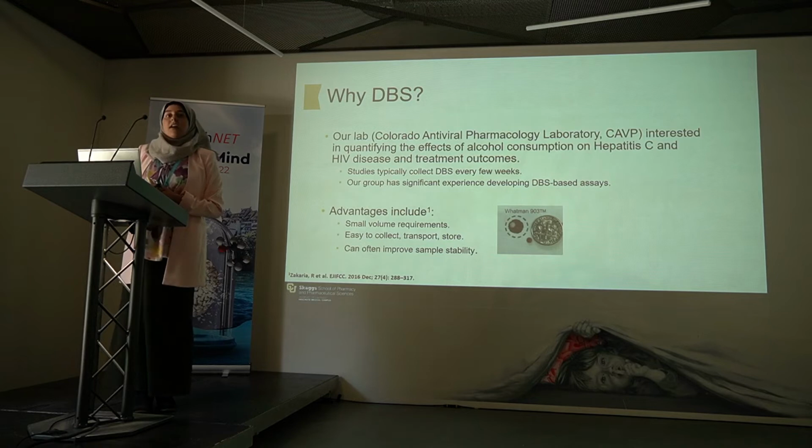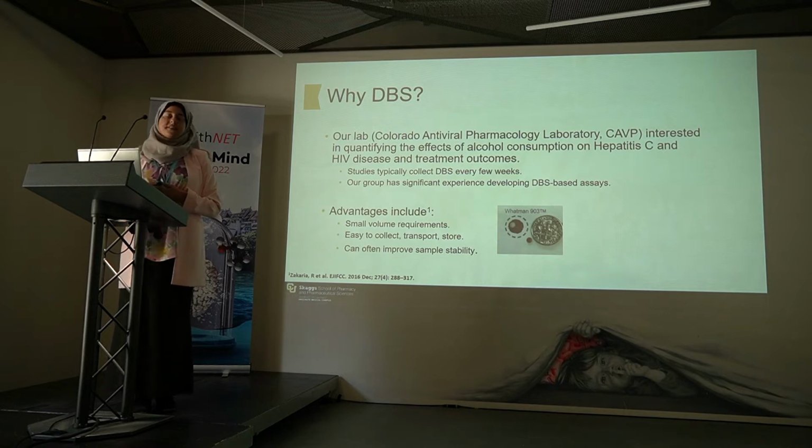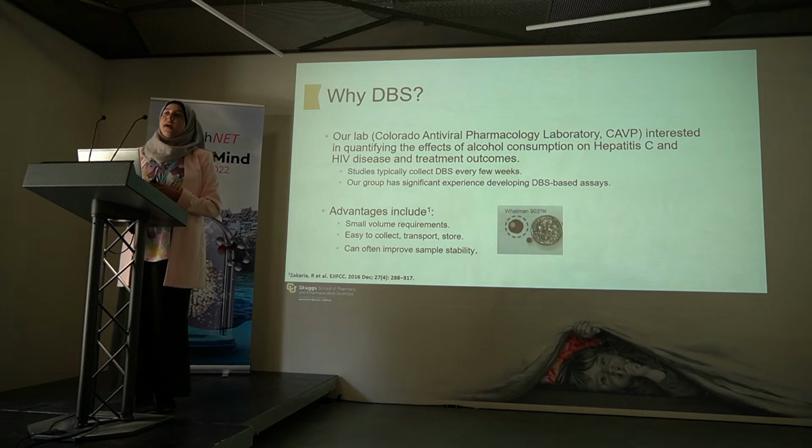So our lab, the Colorado Antiviral Pharmacology Laboratory, was also interested in developing a DBS-based PEth assay for a couple reasons. To begin, we primarily do research in individuals with HIV and hepatitis C, and we were interested in quantifying the effects of alcohol consumption on disease and treatment outcomes in these populations. For our studies, we typically collect dried blood spots every few weeks, and we also have a lot of experience developing DBS-based assays, so this PEth one was ideal for us.